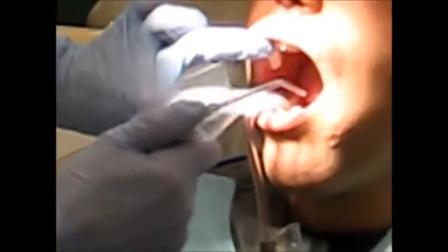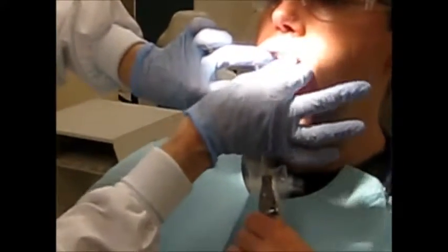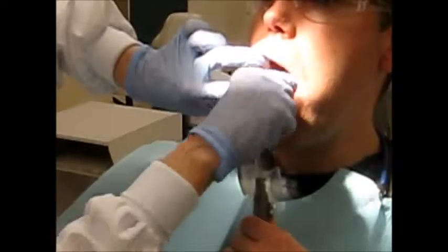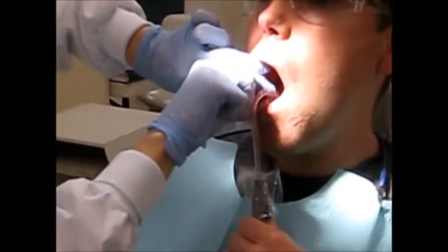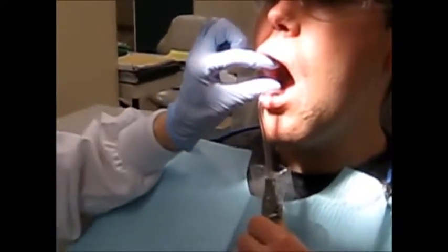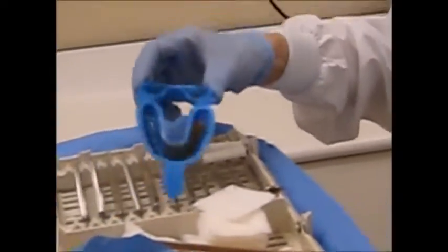Once I've completed drying thoroughly, I'll ask the patient to remain wide open, and I'm going to remove all 4 cotton rolls at one time. I will keep my thumb and my index finger in the mouth in a C shape to allow the patient to remain open.